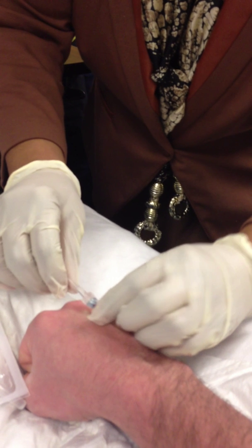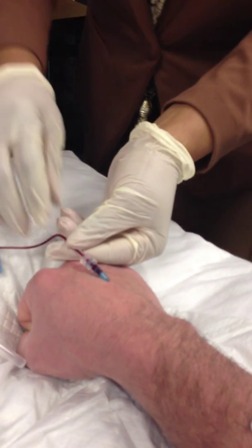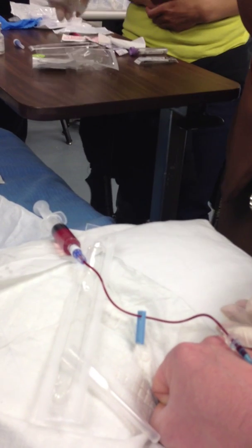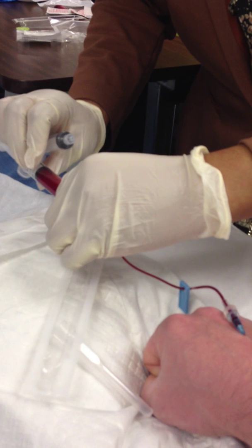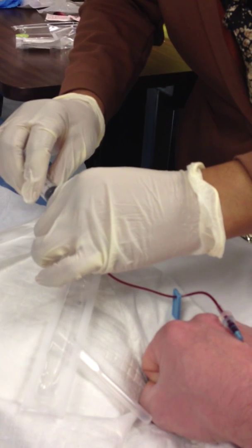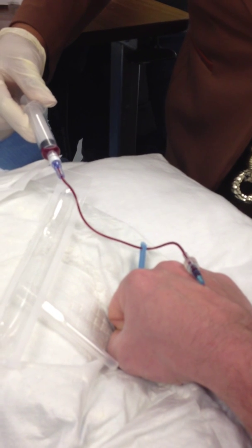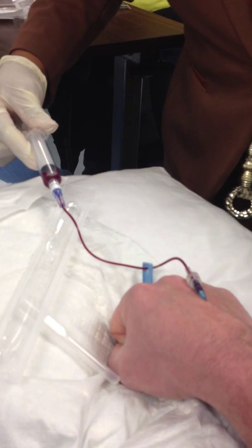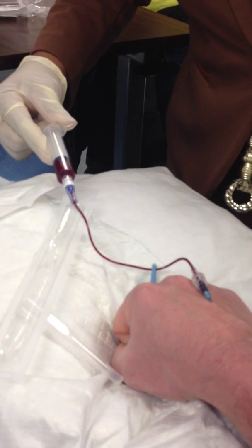I left the tourniquet on because I'm going to draw my lab right now. I'm just going to draw a little bit so we don't want to make him pass out. We got a CBC right now.